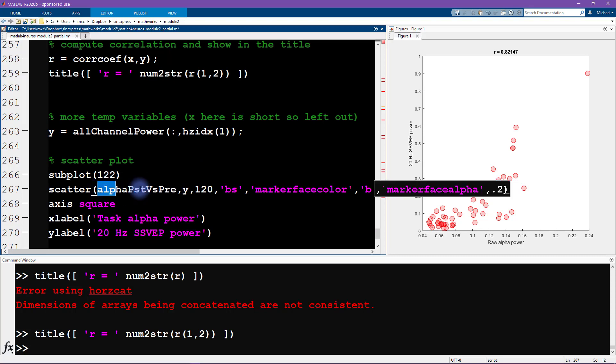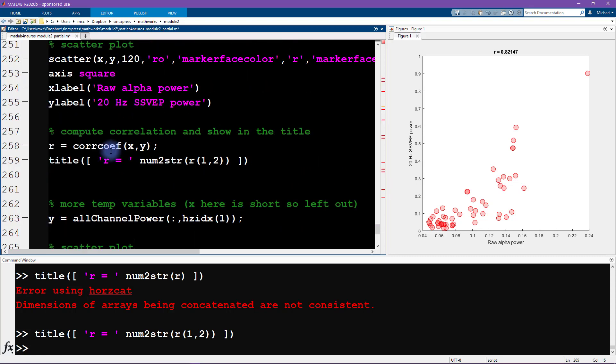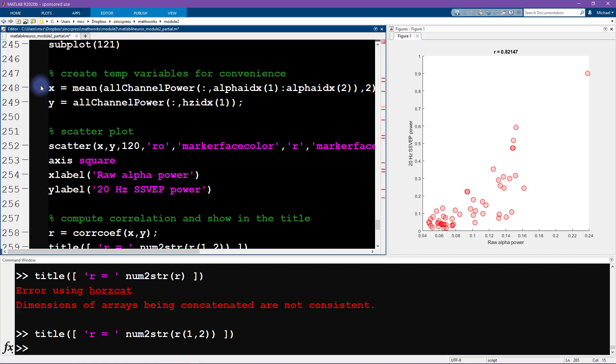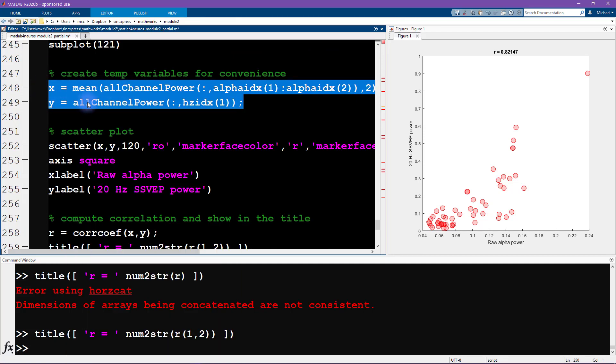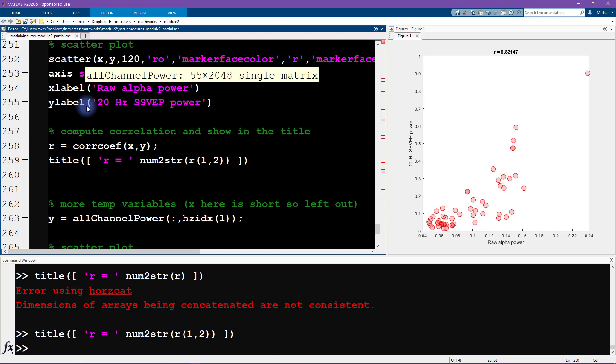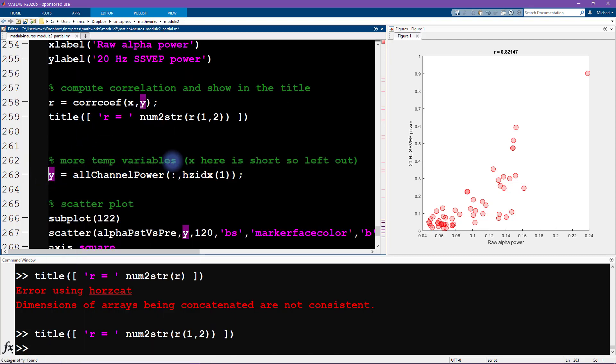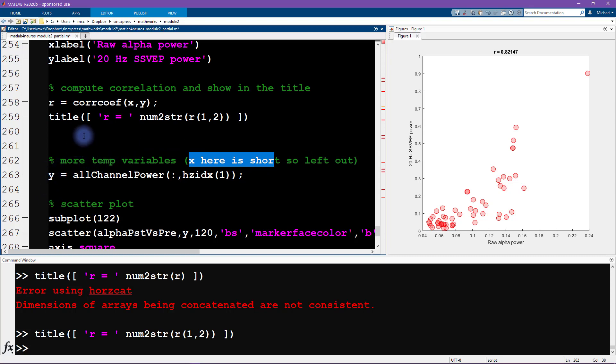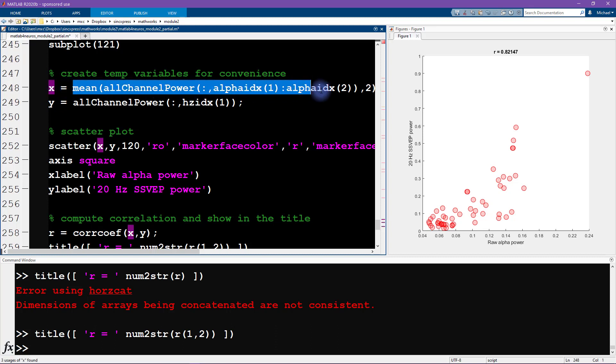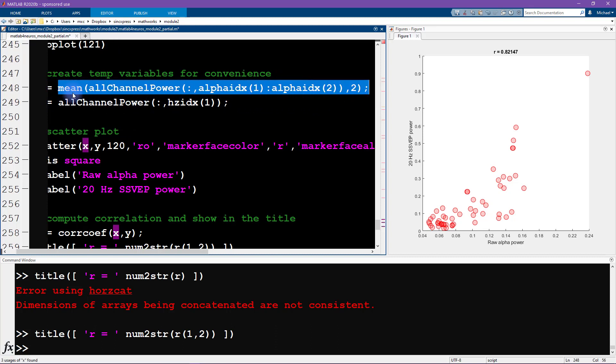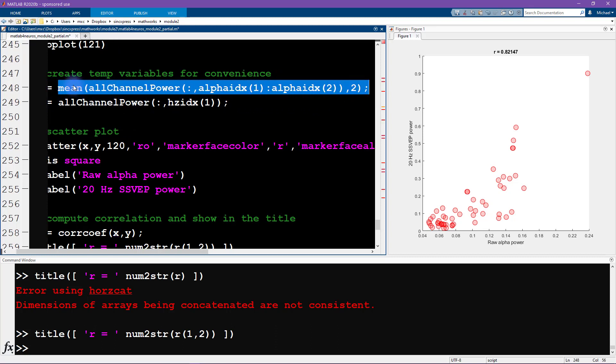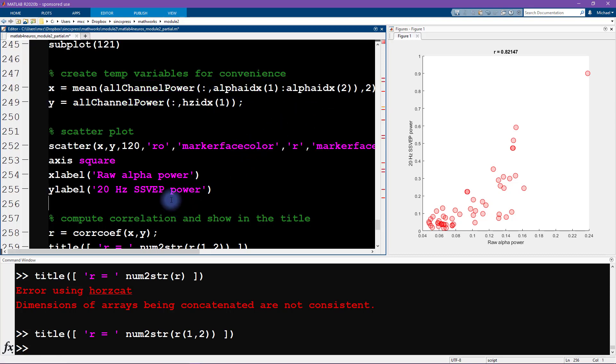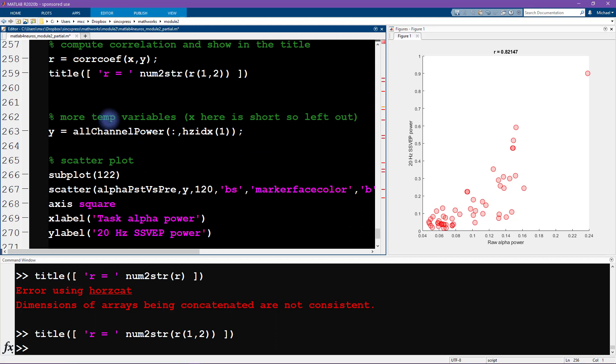Now we want to run the same analysis but for the task modulation of alpha. That was coming from variable alpha post versus pre. Up here we generated x and y or we set these variables to be x and y. Do we also need to do that here? I'm also leaving out x here. We've already done all the indexing and averaging that we need to do, so we only have this one little variable here. Therefore I think it's not really necessary in this case to say x equals this thing.